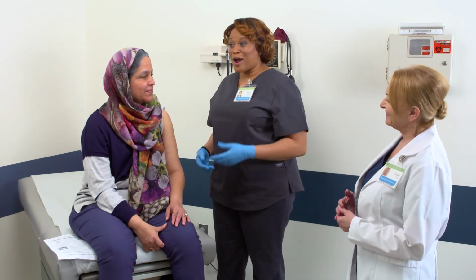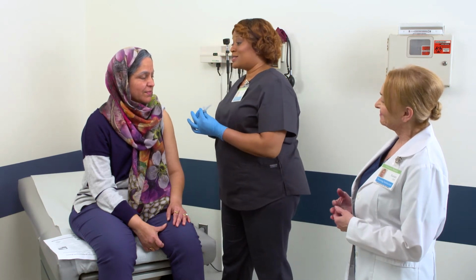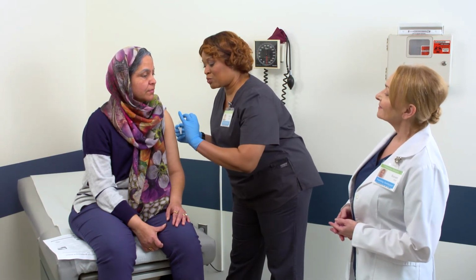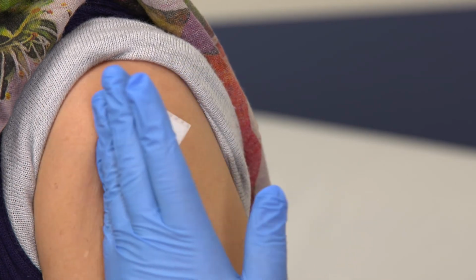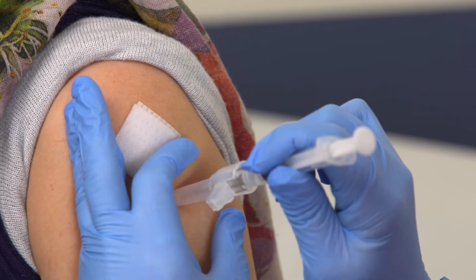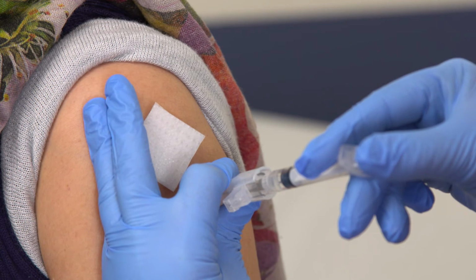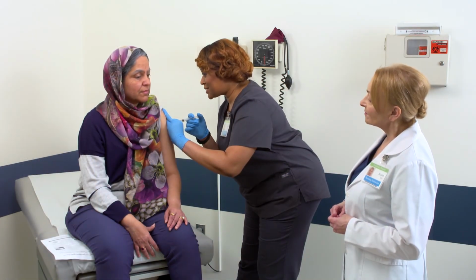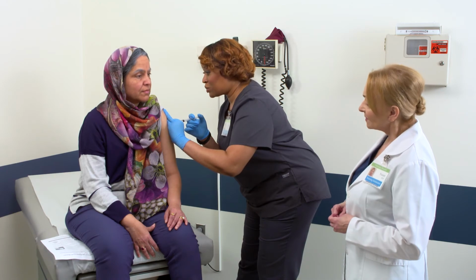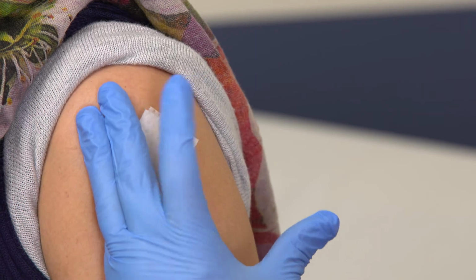Thanks, Ms. Khan. I appreciate your patience and willingness to work with me. So, I would displace the skin with my pinky and hold the skin and underlying tissue down. Then I would dart the needle in at a 90-degree angle, hold the base of the needle like I would for any IM injections, but I would be sure to keep the skin and underlying tissue displaced. I'd inject slowly, 10 seconds per milliliter, hold the needle in place for 10 seconds, and then remove the needle and release the hold on the skin.